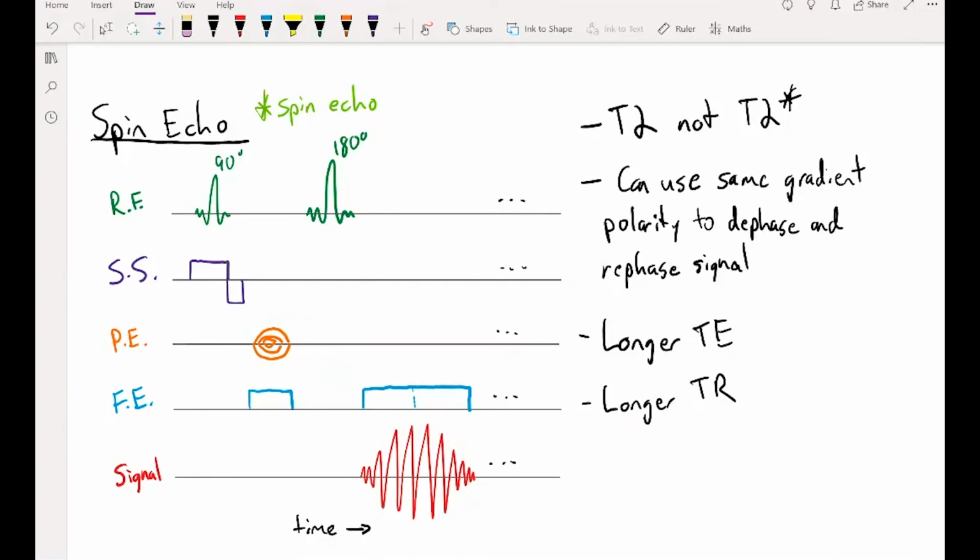If we just have one phase encoding condition and one frequency encoding condition, the Fourier transform is going to have trouble distinguishing whether the main signal that we see at any given point in that echo is driven by a combination of signals at different frequencies and amplitudes, like we've been talking about so far, or signals that are more similar, like the exact same signal with the same frequency at different phases.